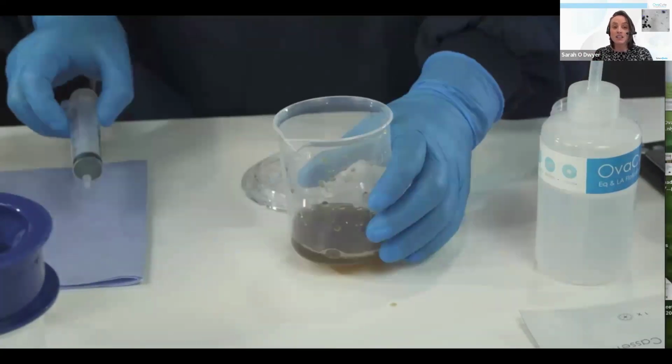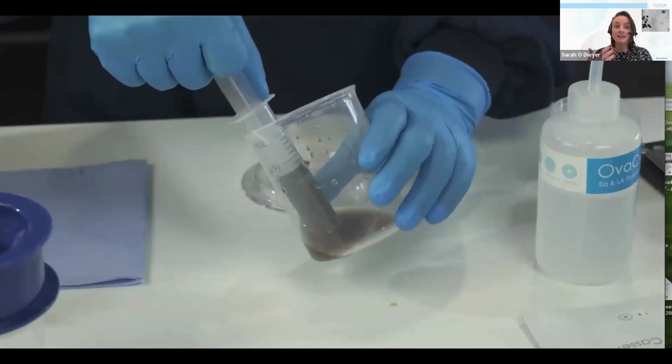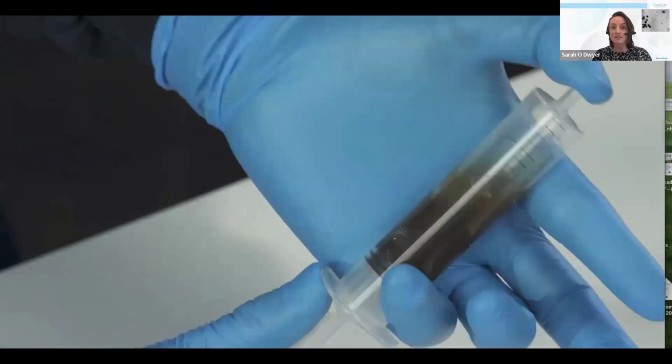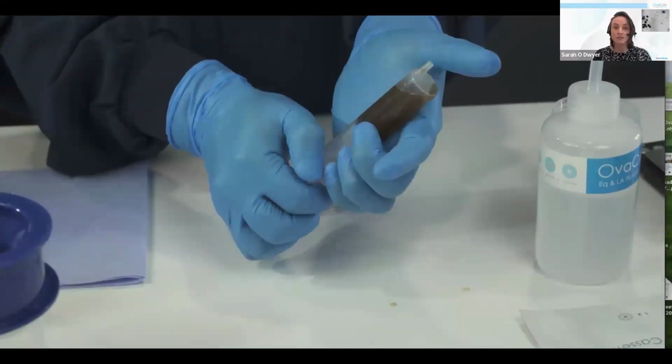And then you're agitating and swirling the fluid again to get a representative sample. So this is the degassing part. And as vets, vet nurses, techs, we're all really used to handling syringes.